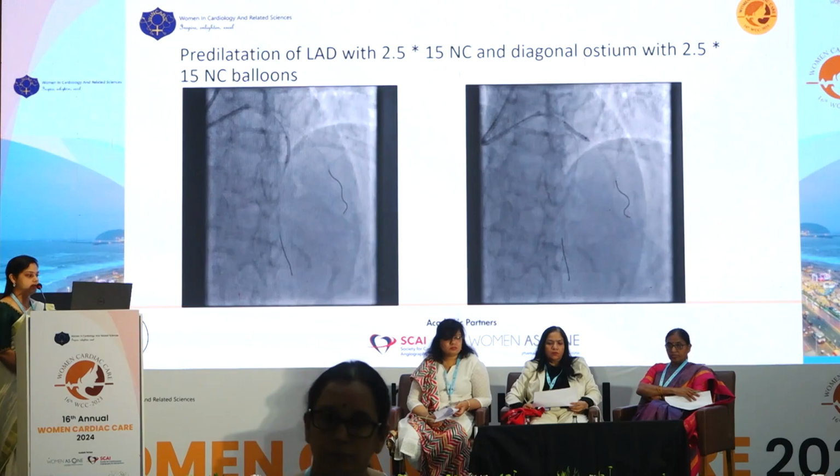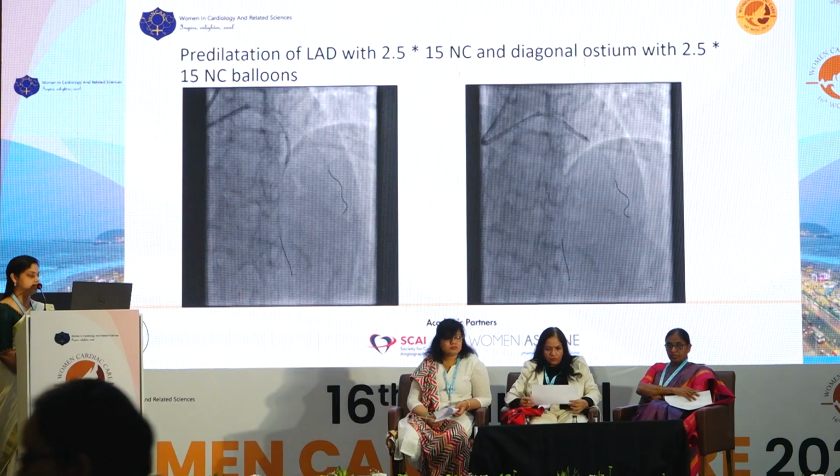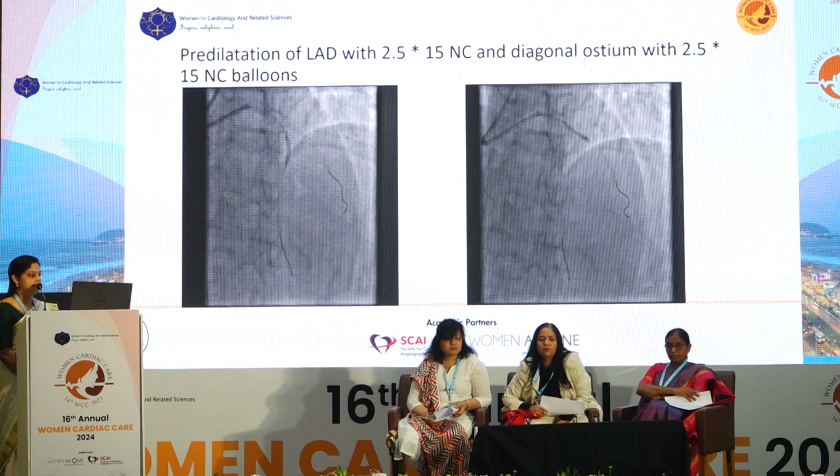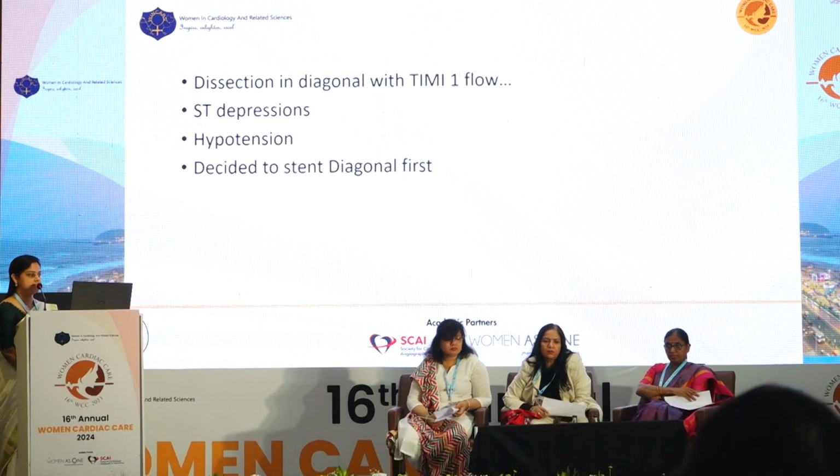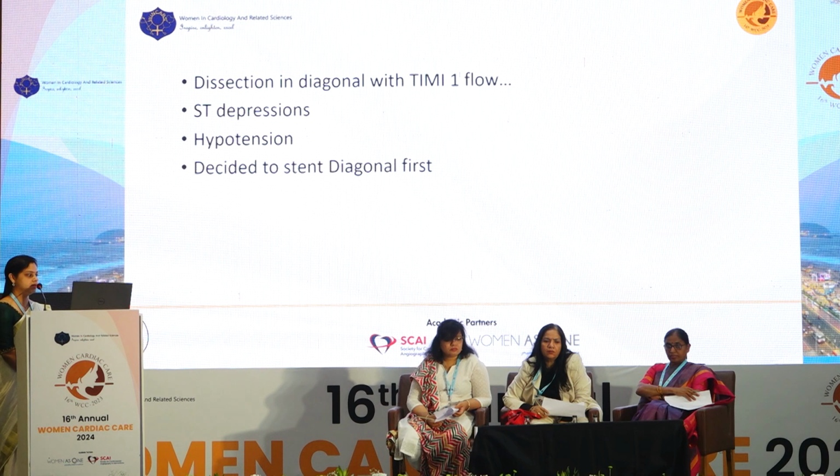So first we stented the mid-segment of the diagonal, and then coming to the bifurcation, predilatation of LAD and diagonal ostium was done with a 2.5 non-compliant balloon. Immediately after predilatation, the patient had angina and started having ST depressions and hypotension. On check, we noticed that there was a dissection in the diagonal with TIMI 1 flow.